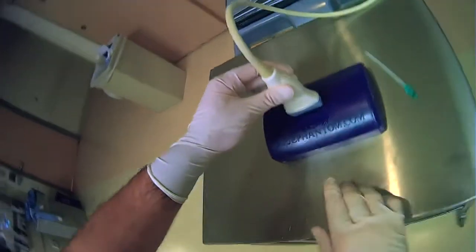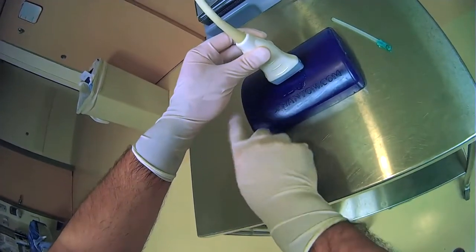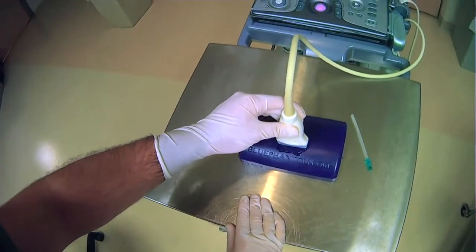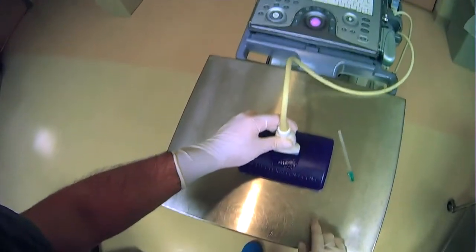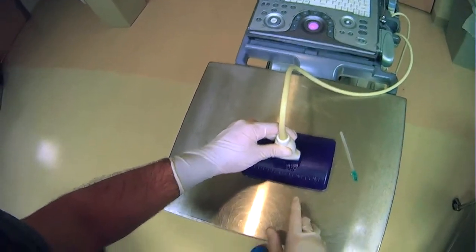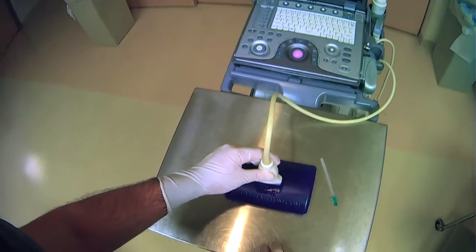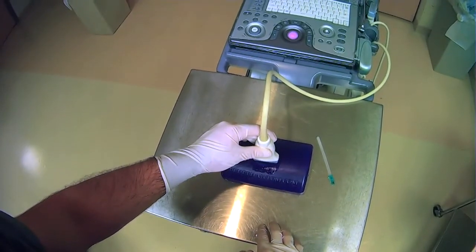And if you look closely, you can see that if you do this, your hand is kind of floating in air. It's not stabilized by anything. Now this may work if you're quickly scanning, but over time your hand can become tired and its instability may compromise the integrity of what you're doing.